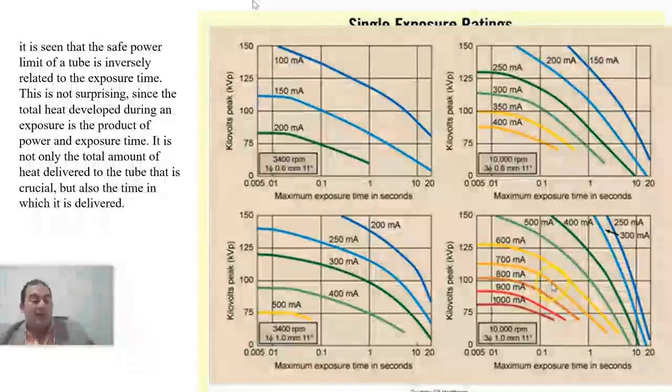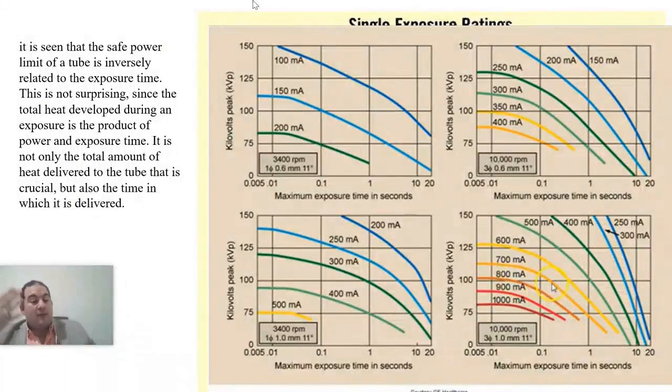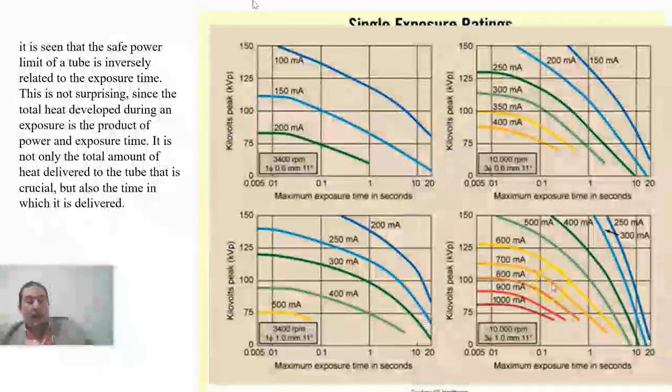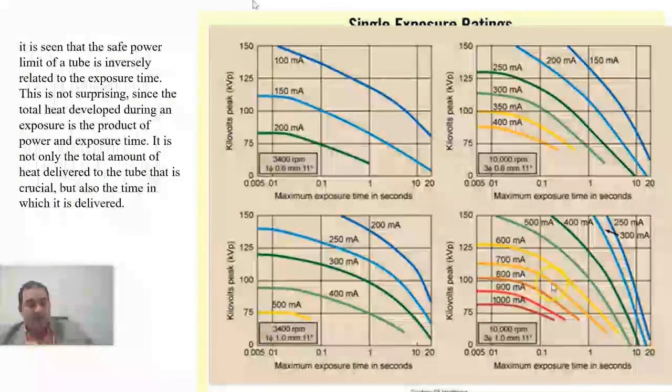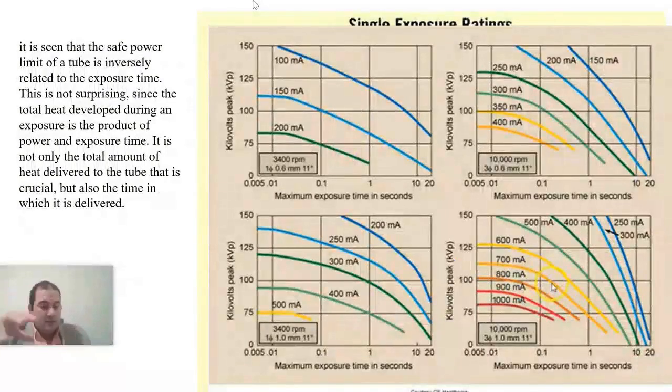In lower limb angiography, the technique for lower limb angiography, for example, on a 16 slice or 16 row CT machine, is done how? It is taken on the Toshiba Activion 16 row detector. The old one was done in about 40 seconds. But when they increased the table speed a bit, it was done in about 25 seconds. Now there are two machines from Toshiba.